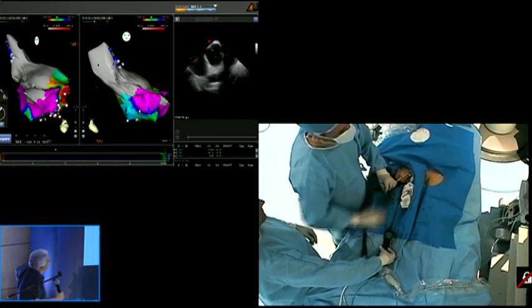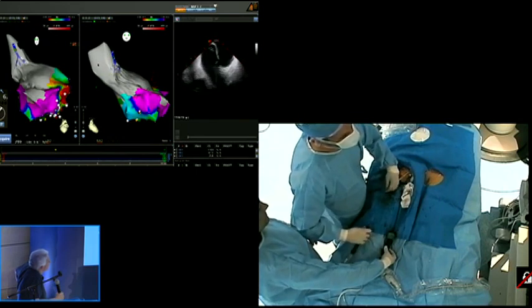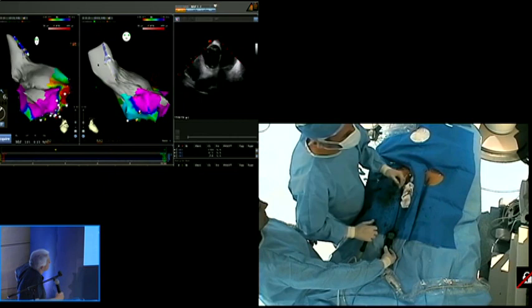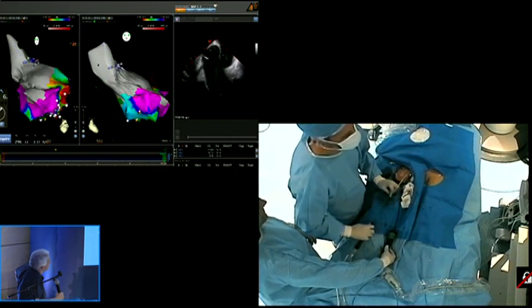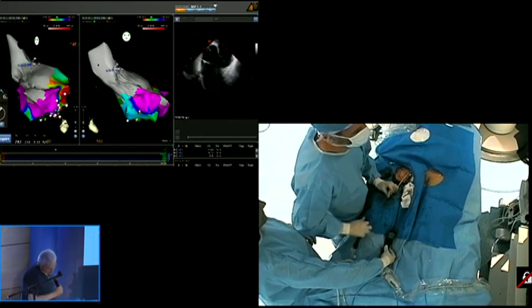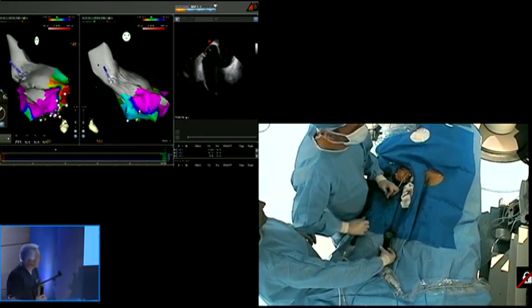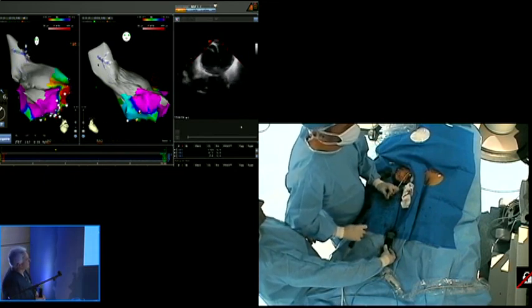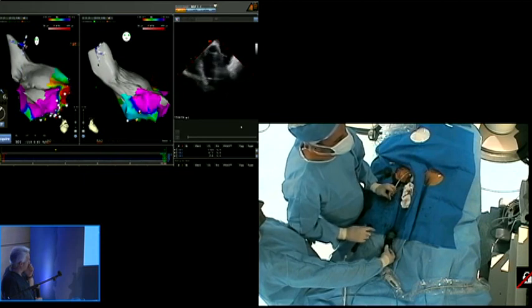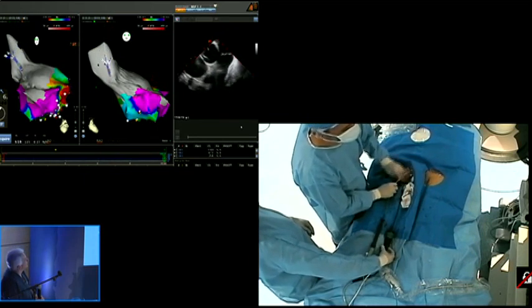Loop it. Okay. Trying to. I know you're looking at it, and you're saying, why doesn't he fluoro? I have to get some lead. Oh, you don't have the lead. Okay, that's right. That's a good reason. I mean, a cusp. All right. A little bit of loop, and then I'm going to go with the entire thing.